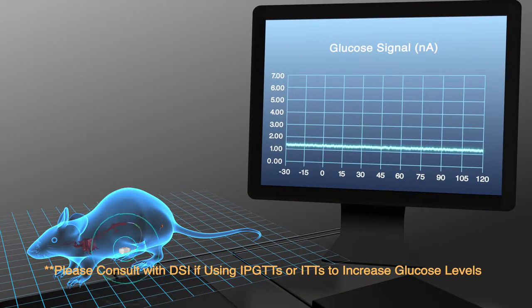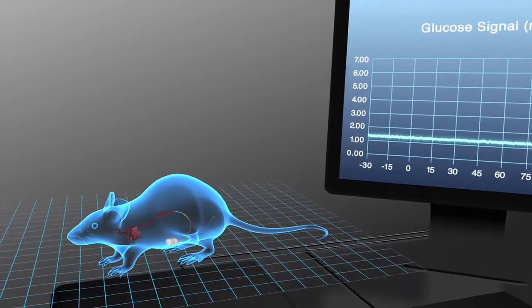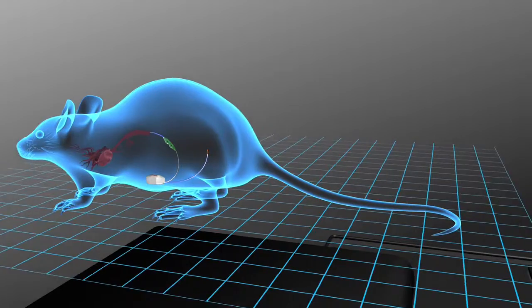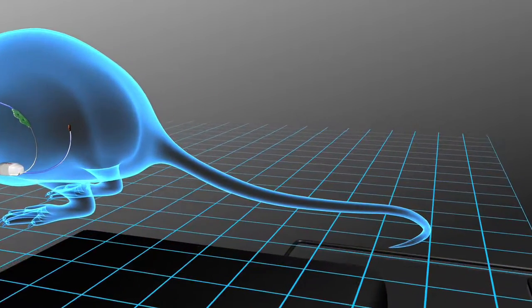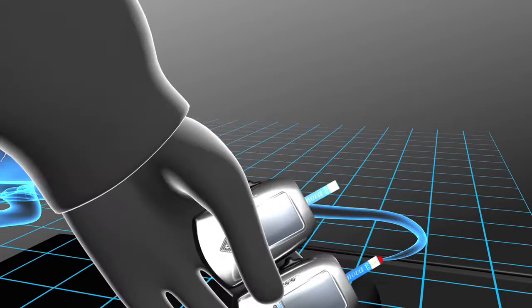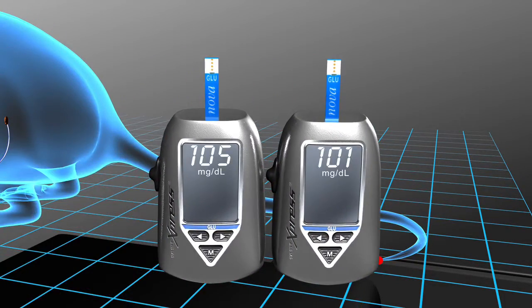View the continuous glucose telemetry data in the DSI software program. While the study animal has a steady baseline glucose value, draw duplicate blood samples. Taking duplicate samples helps to minimize error and establish reliable calibration. Simply draw blood and test it twice, such as with two separate test strips and glucometers.